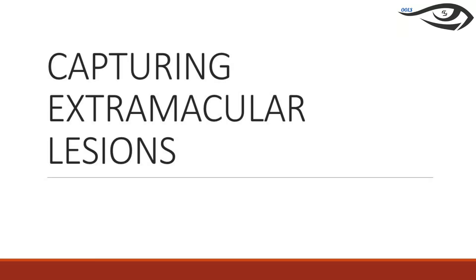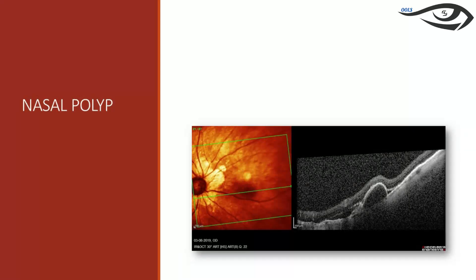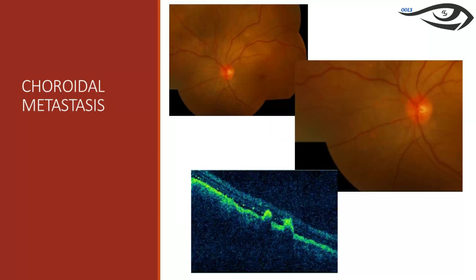OCT can also be used to capture lesions not in the macular region — you can place the macular cube over any area of interest. For example, a retinal detachment inferior to the disc, a nasal polyp, or choroidal metastases from breast cancer can all be imaged by centering the cube on those areas.